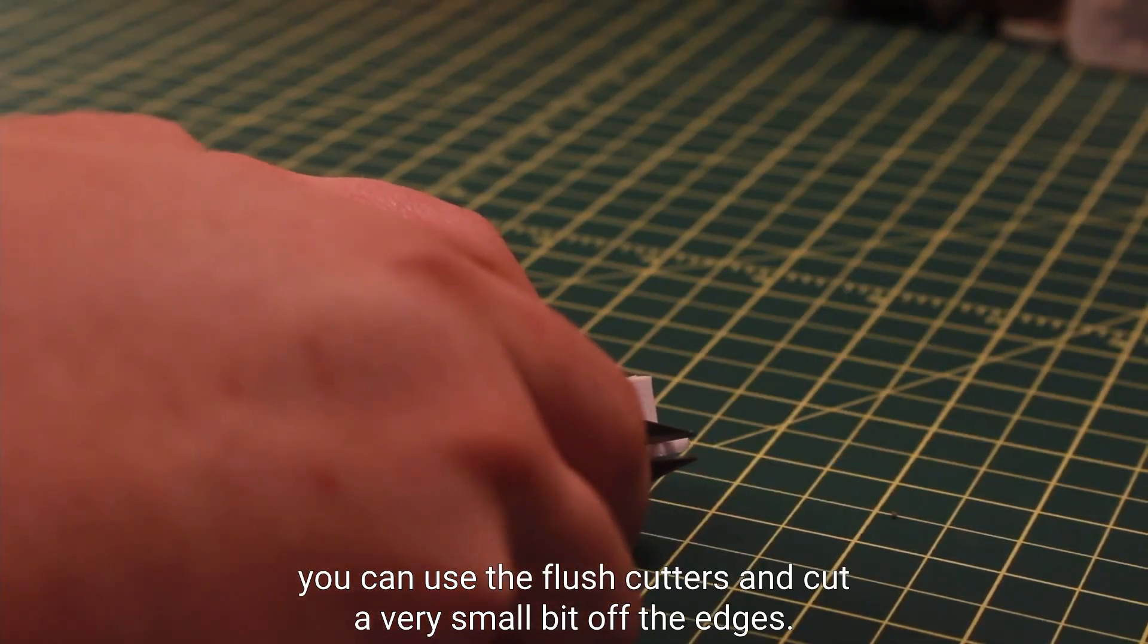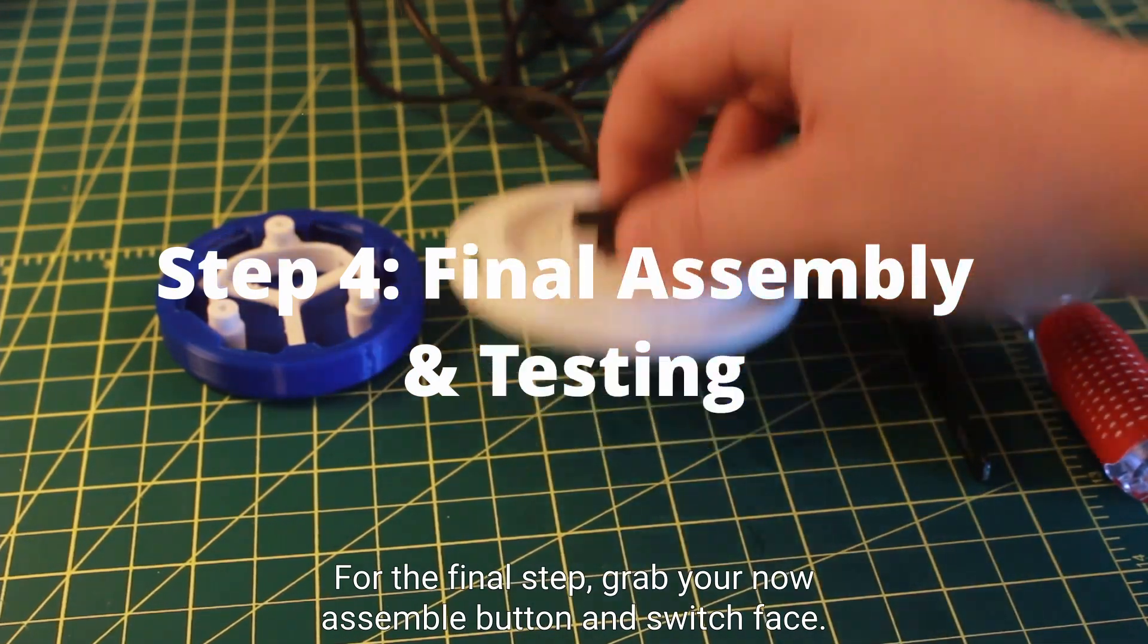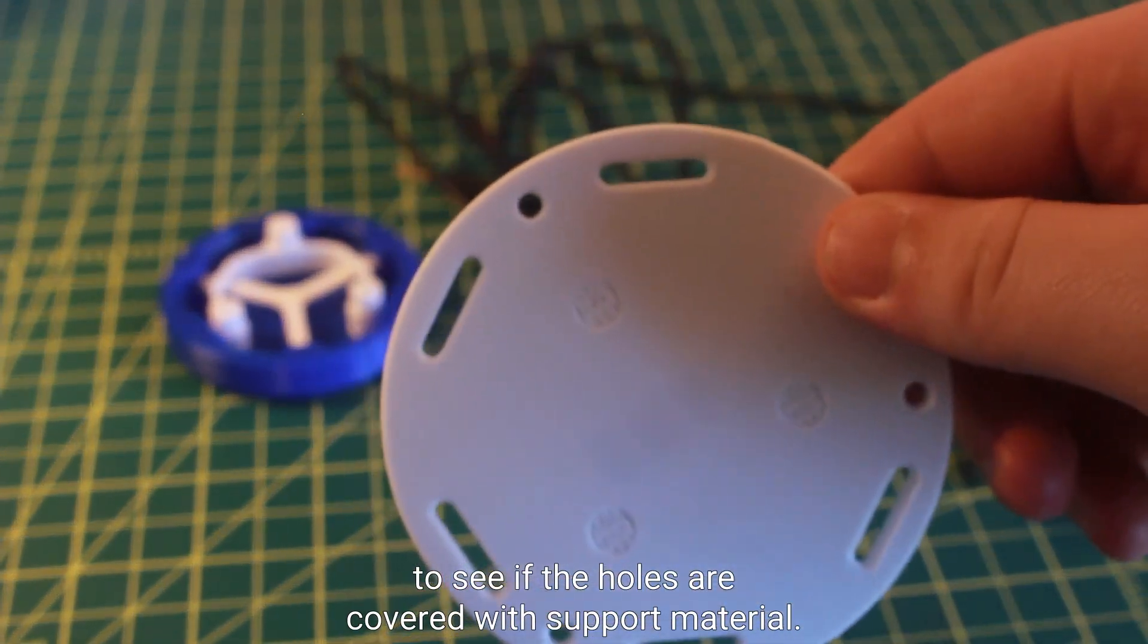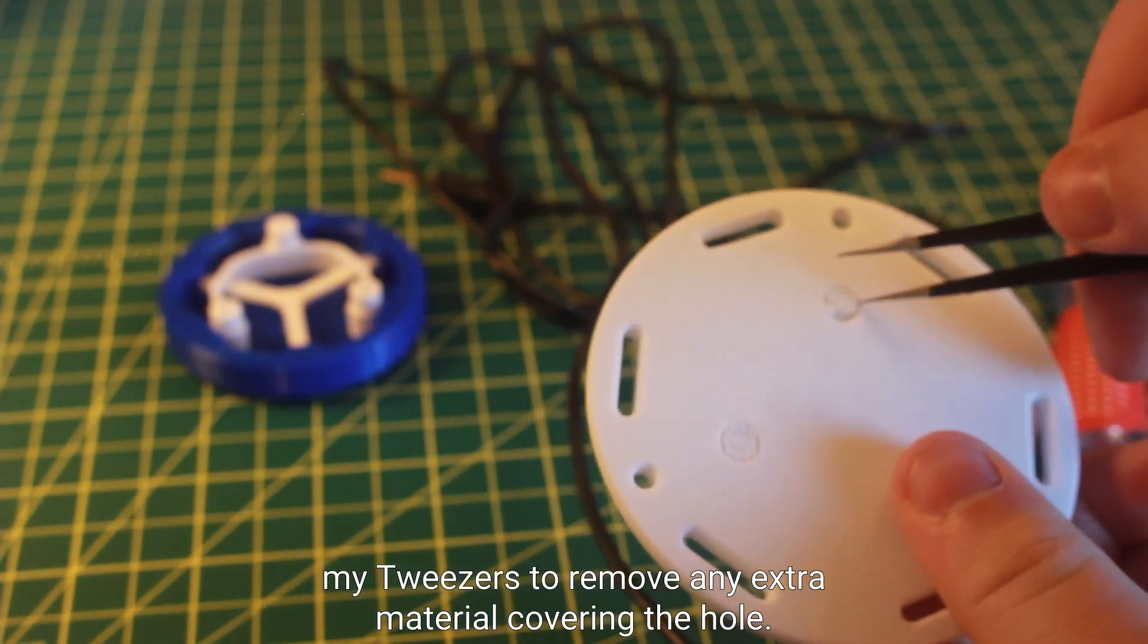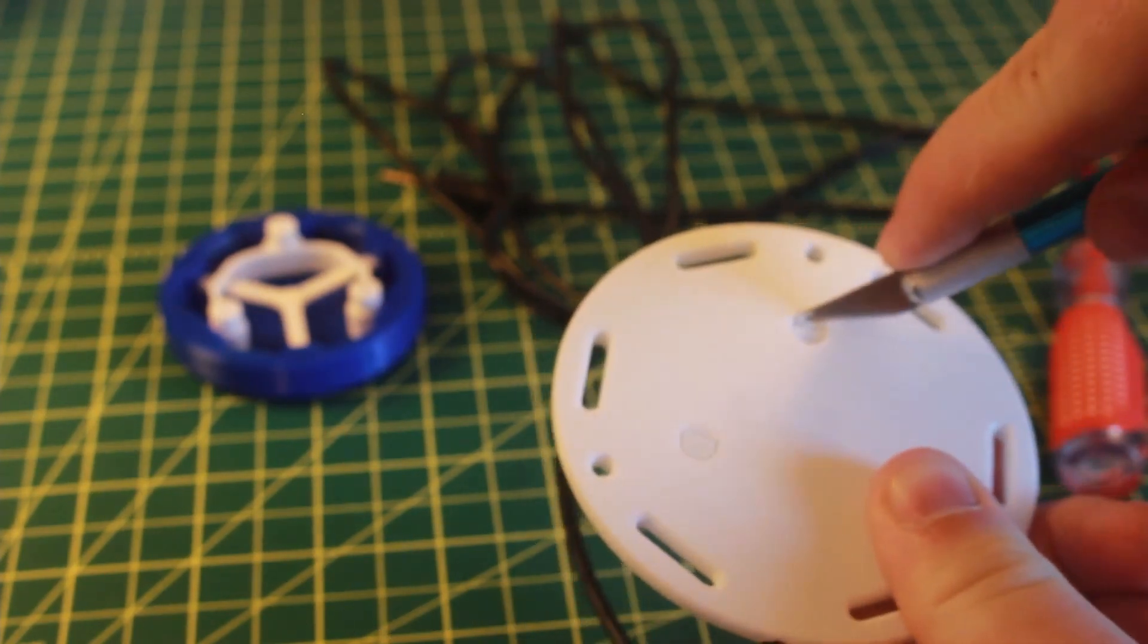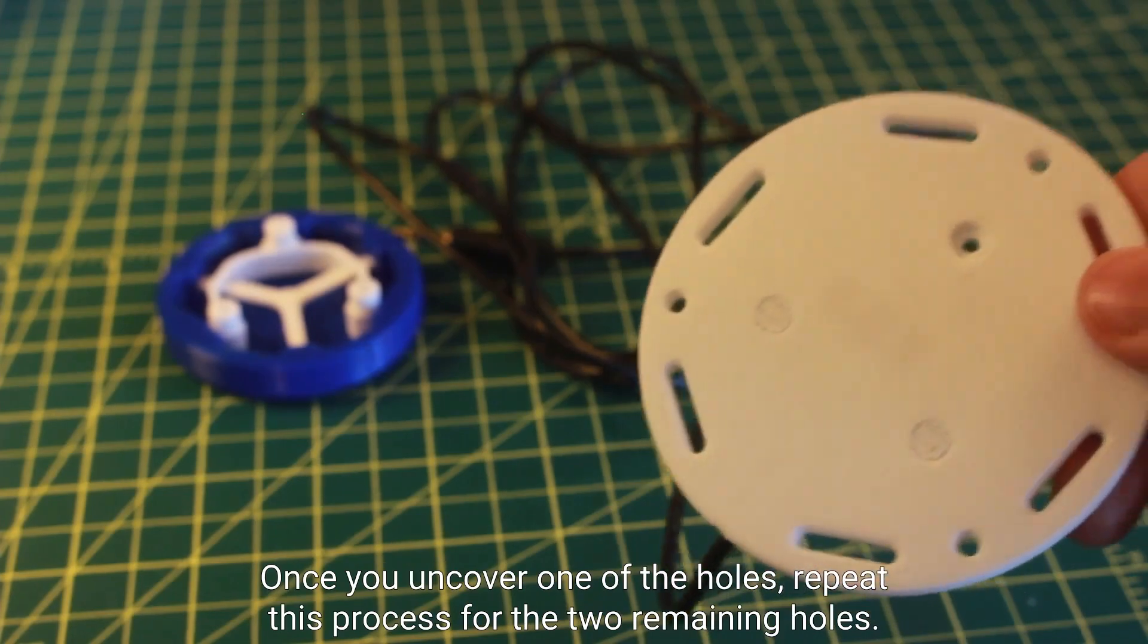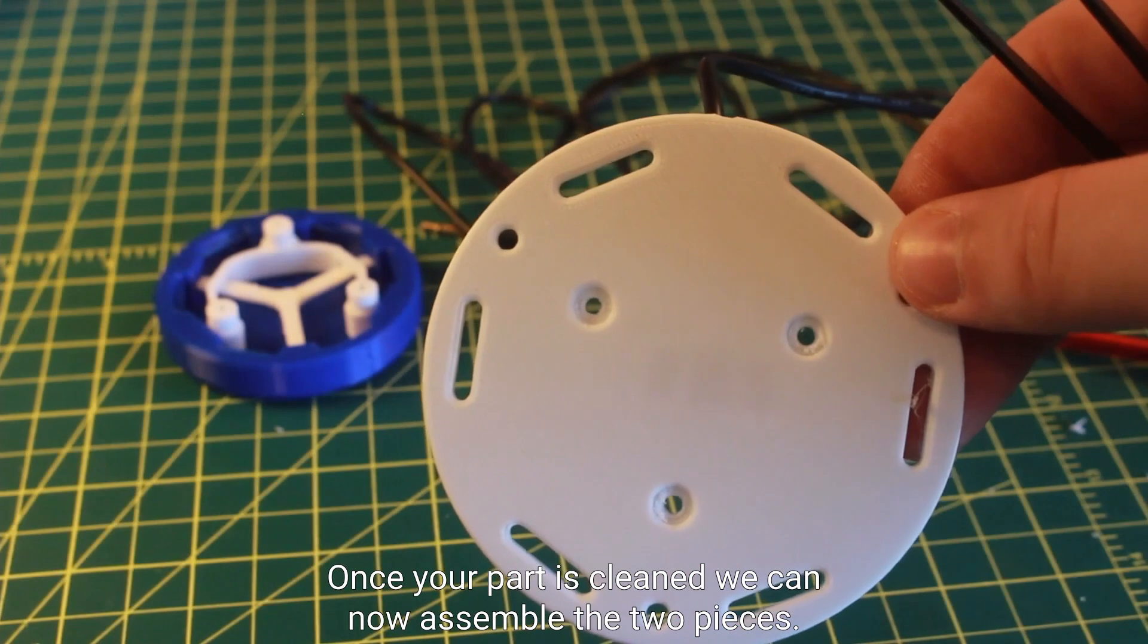For the final step, grab your now assembled button and switch base. Check the bottom of your switch base to see if the holes are covered with support material. In my case they are, so I'll use my tweezers to remove any extra material covering the holes. You may also like to use the hobby knife or even the screwdriver to help in this process as well. Once you uncover one of the holes, repeat this process for the two remaining holes. Once your part is cleaned, we can now assemble the two pieces.